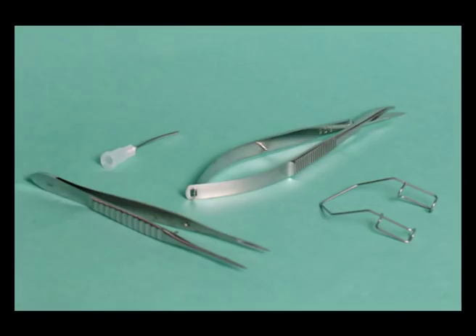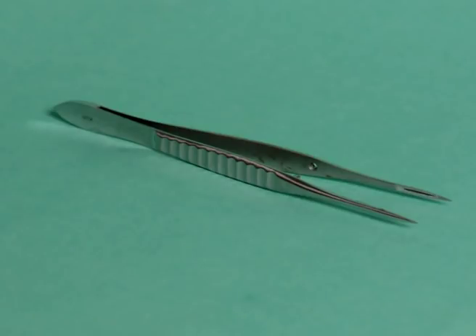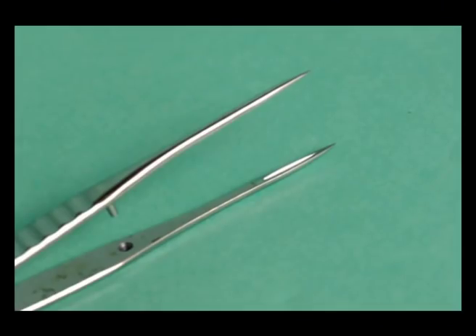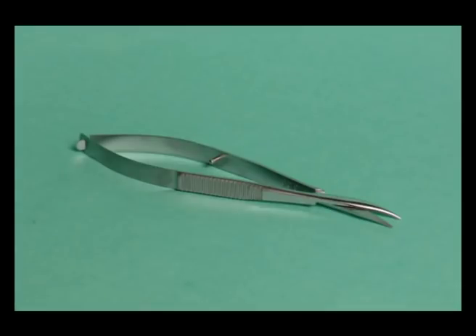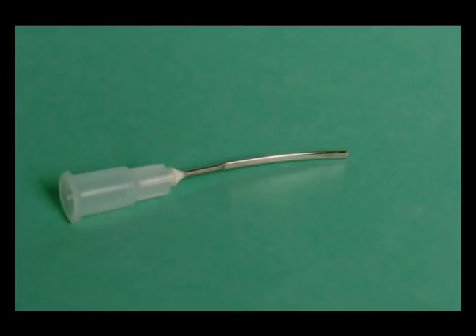Here's the equipment that you'll need to perform a Sub Tenons block. At the Eye and Ear we have pre-prepared Sub Tenons kits. These kits contain an eyelid speculum, a pair of Moorfields forceps, these are non-toothed forceps, and a pair of Westcott spring scissors. In addition to this, you'll need a Sub Tenons cannula. We use a 25mm 19 gauge Stevens style cannula. This means that the distal portion of the cannula has a flattened cross section.